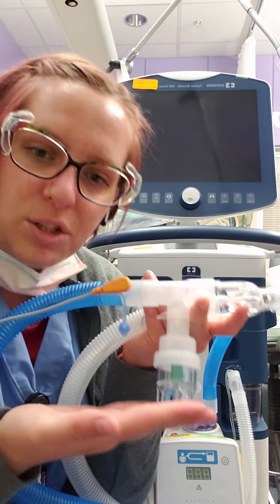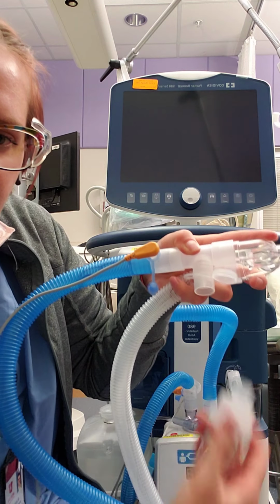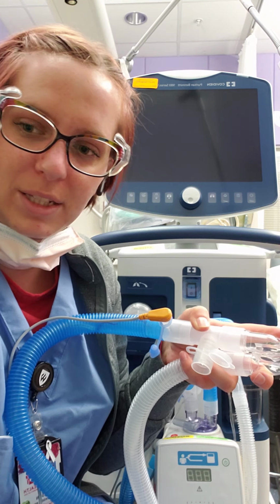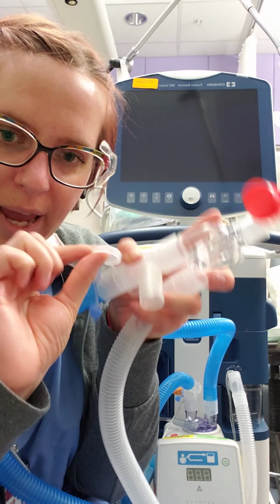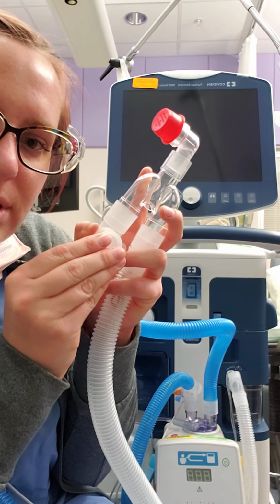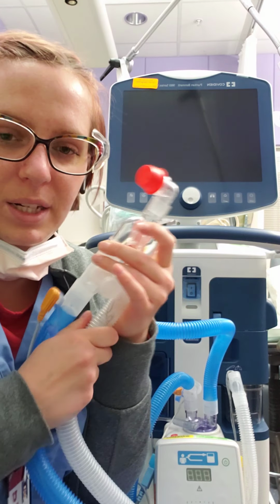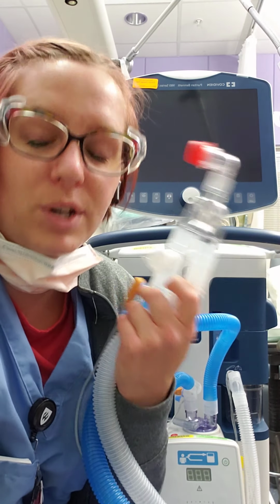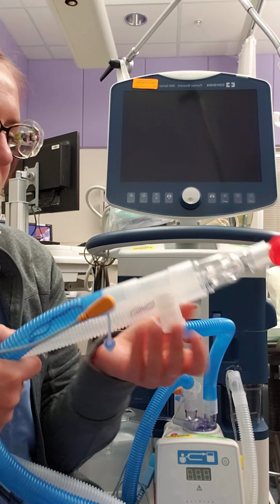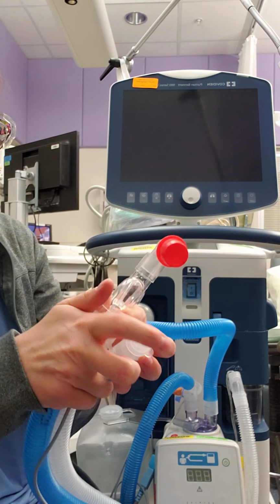Okay, this medication's done. We're done with it. We take it out of line, put it in a clean space so that it's clean. Take this little cap and see how it fits right on top. This allows just another barrier in which to keep your circuit clean and prevent any type of pneumonia or infection transferring to your patient. That is the spring T adapter.